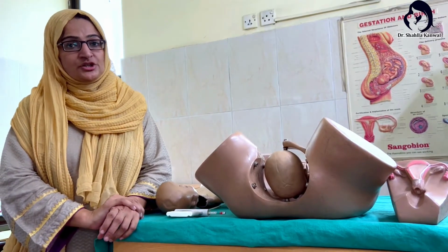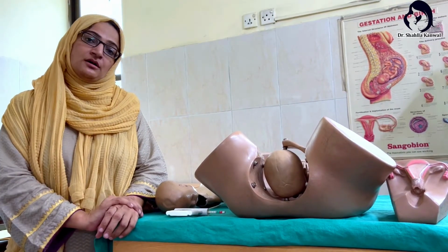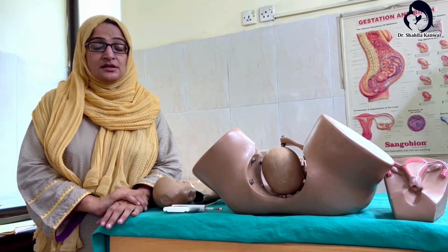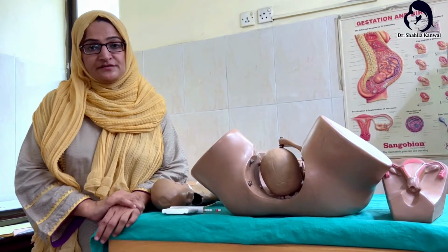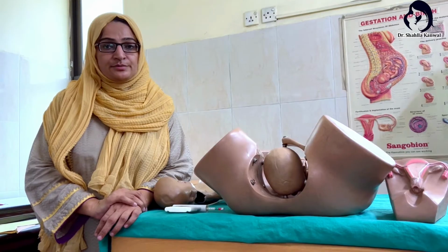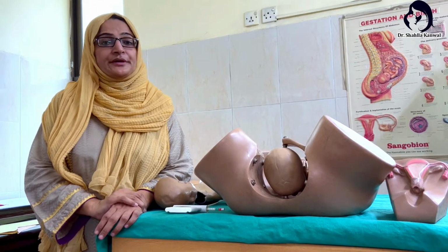The contraindications will be that there should be no preterm fetus, and a term fetus can only be delivered by this operative vaginal delivery, and there should be no face presentation and no cephalopelvic disproportion. How can we prepare the patient?